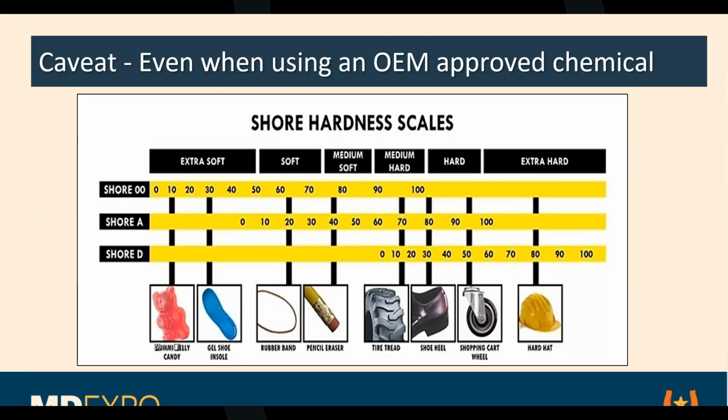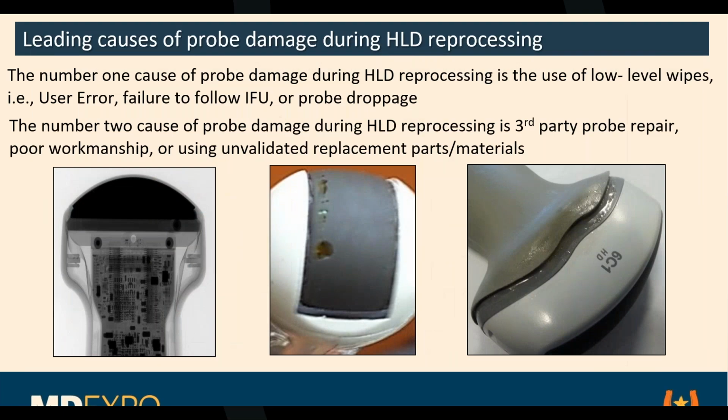So they're resilient, and they've been tested to that thickness of the probe when it's initially put on. After it's been buffed off or used for a long time, it can change. And you can see what would happen if the lens is supposed to be like this, and a third-party user uses an RTV that has the Shore hardness of a pencil eraser. Not going to last. It may not even last 1 cycle. And that was what happened here. This was a third-party probe repair.